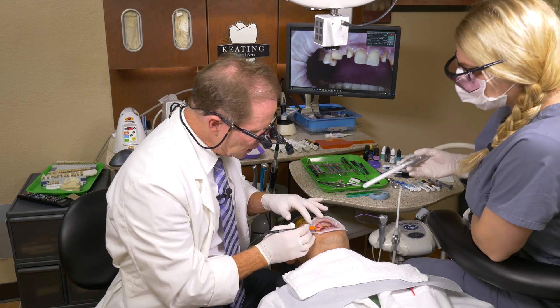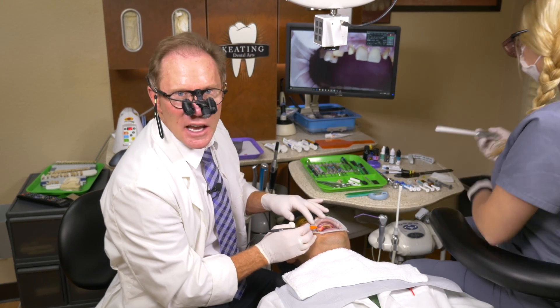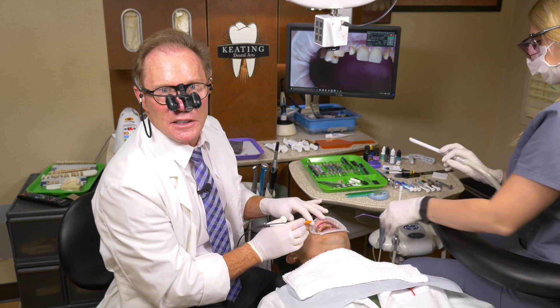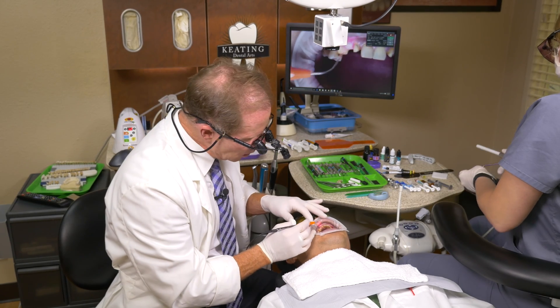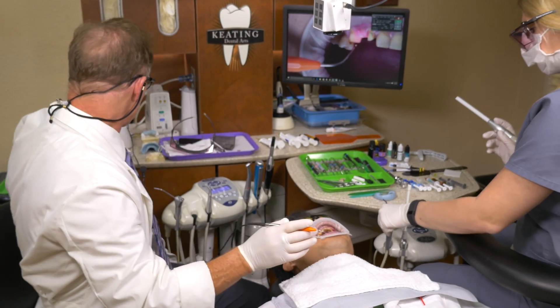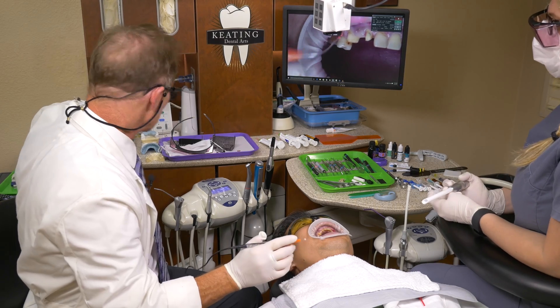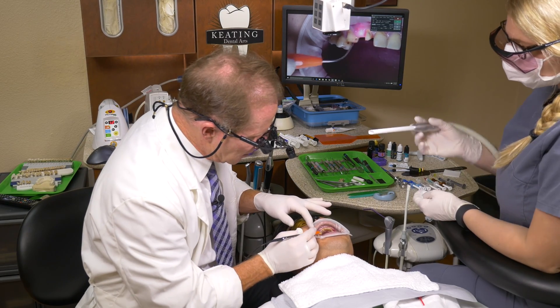As you can see, there's a little red beam — that is actually the aiming beam, that's not the laser itself. In fact, the laser's not even turned on. Normally we'd use this so that we could see a little bit better, but because of photographic purposes, I'm actually going to turn the aiming beam off.